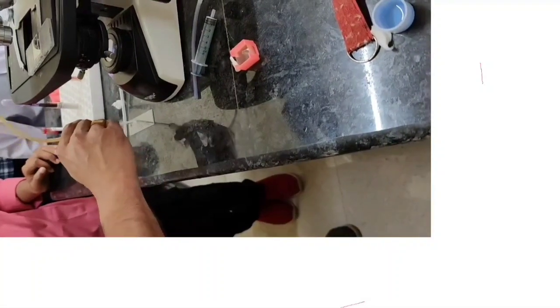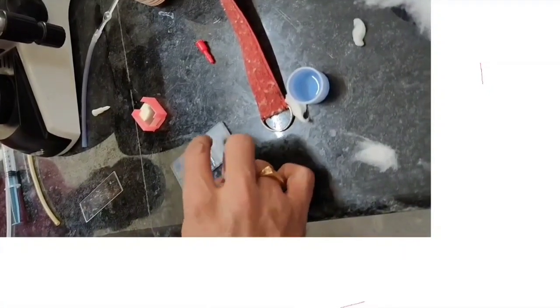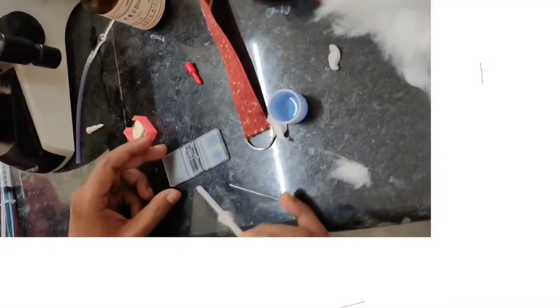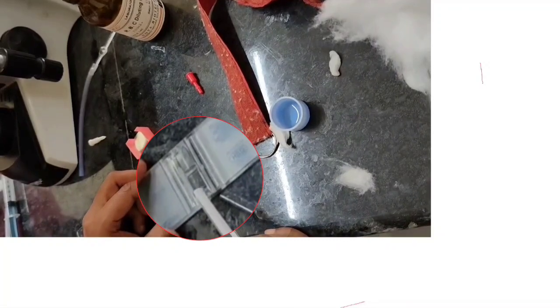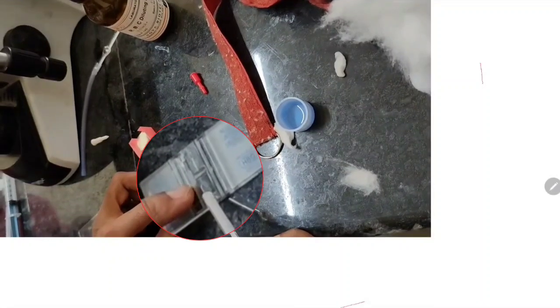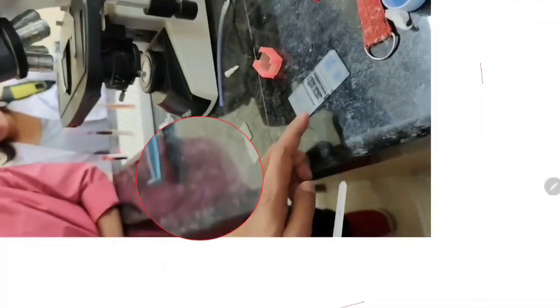So by tapping I am discarding it. A few drops we have to discard. So now I am going to charge it. Make sure that after discarding up to the stem part, we make a small drop at the tip, and see, the fluid is going inside by capillary action. So it's going, it's done, charging is already done.